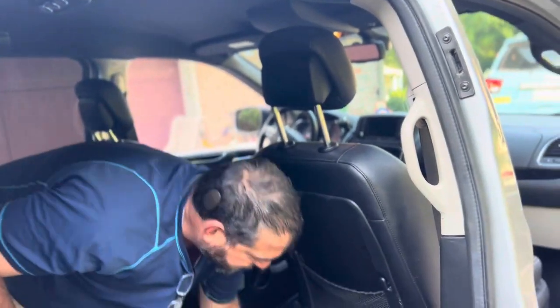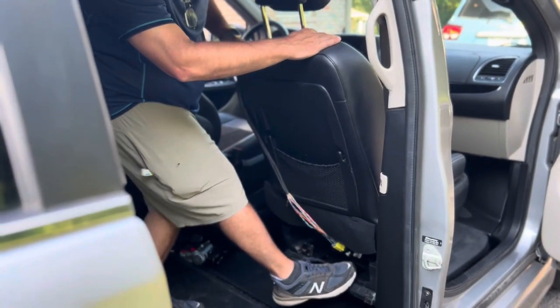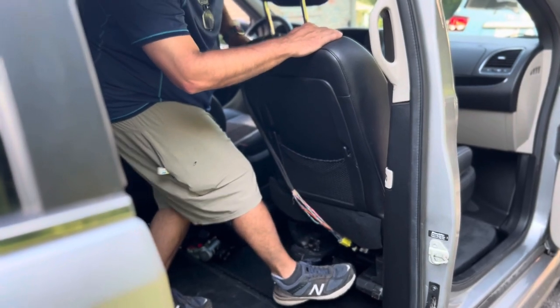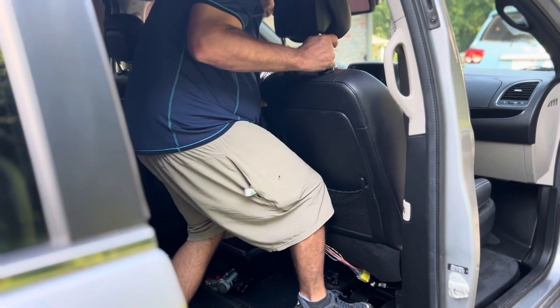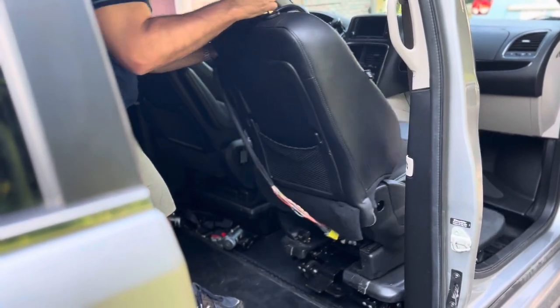The way to remove the seat, if it hasn't been already, is to press on the right-hand pedal here, which will then lift the seat up and out of the grooves, and then you just pull it back.